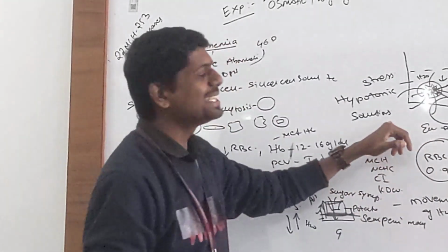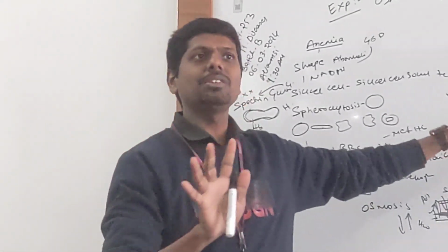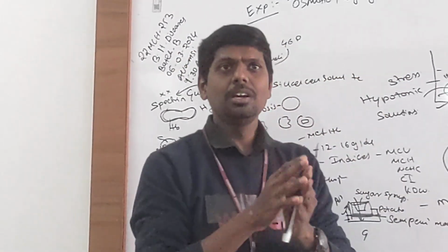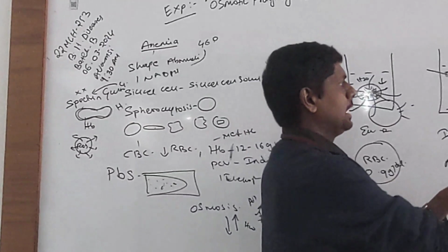Anyway, yes, hypotonic solution, you understood, right? In hypotonic solution, what happens to the red blood cell? It will enlarge, very good. Now, let us reverse the scenario.